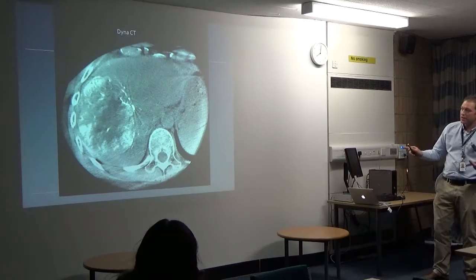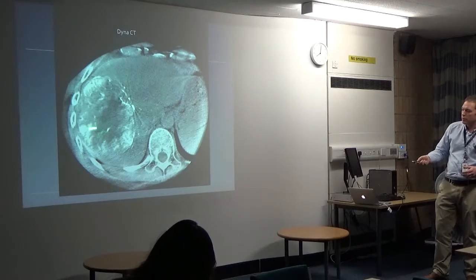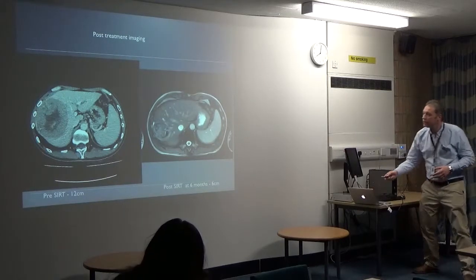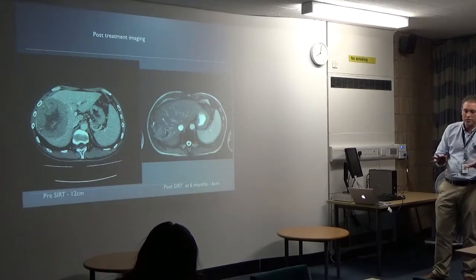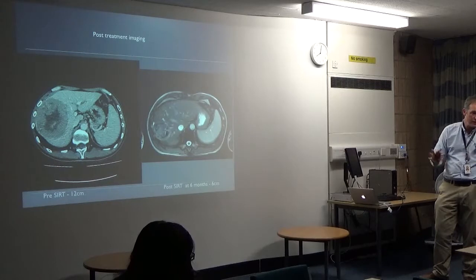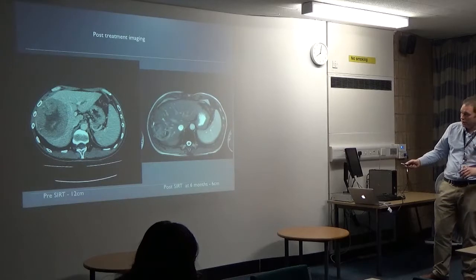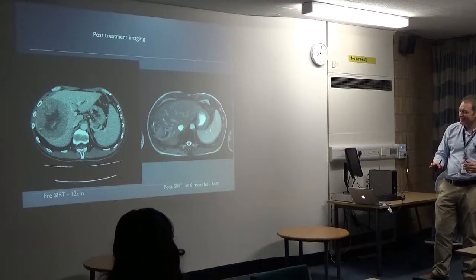And we've taken a picture on one of those special CTs during the procedure, and you can see how bright this is, that's really reflecting all the blood vessels within the tumour that are going to suck up the treatment. And here you can see, this is before we gave SIRT treatment, so it's a huge thing, and at 6 months it shriveled up to a little tiny lesion that probably doesn't contain that much cancer anymore. It's pretty well all dead, and it's really shriveled right up. And then in selected patients, you could, Mr. French, interventional radiology can't quite do total liver resections just yet.